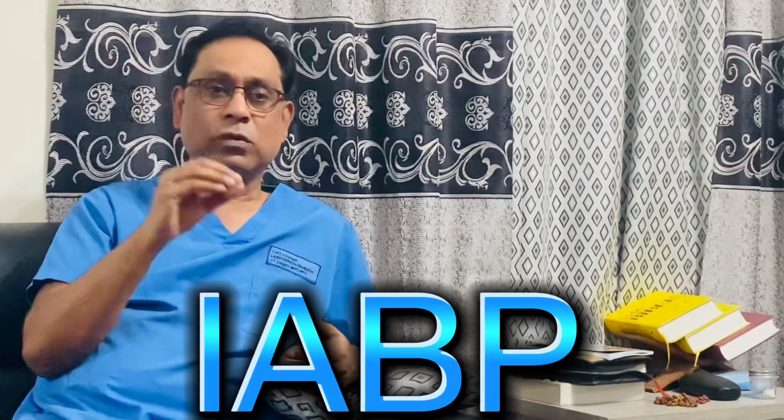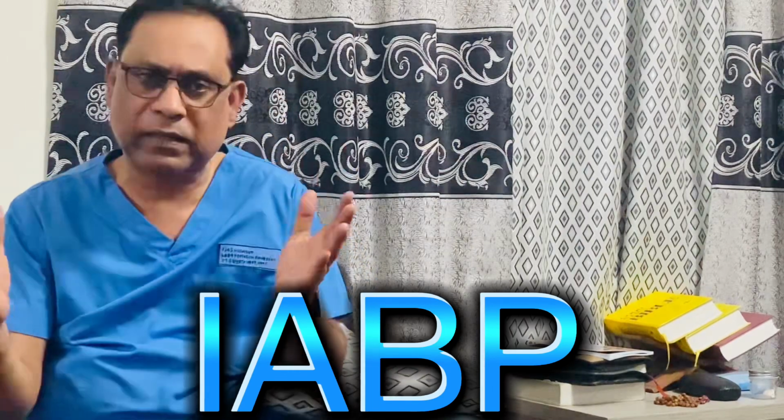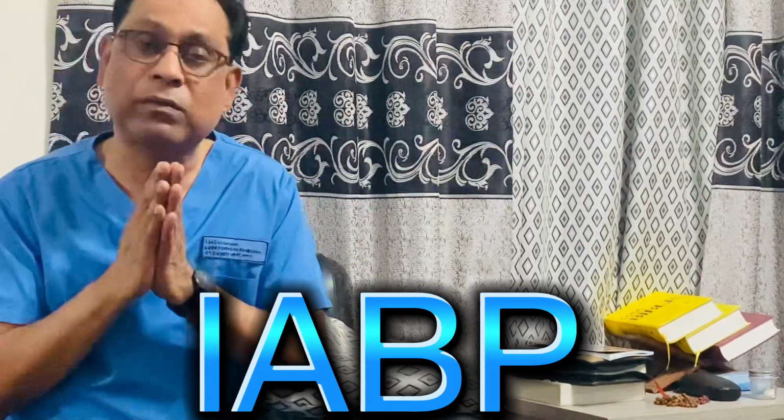I just want to add a few more things. With the balloon pump, the main work done by the balloon catheter is to inflate and deflate.